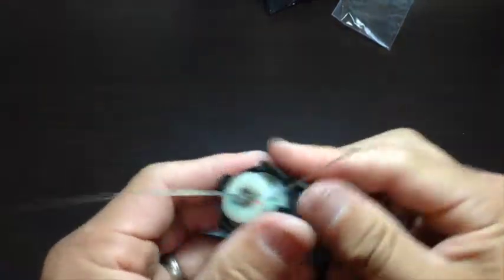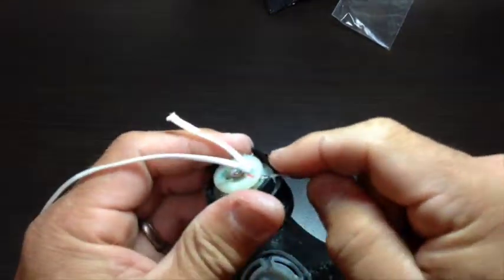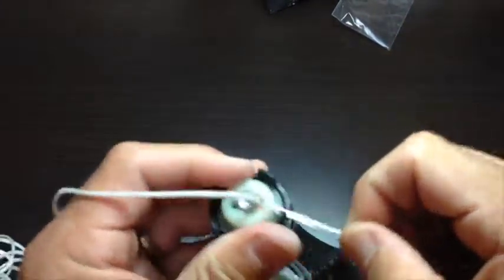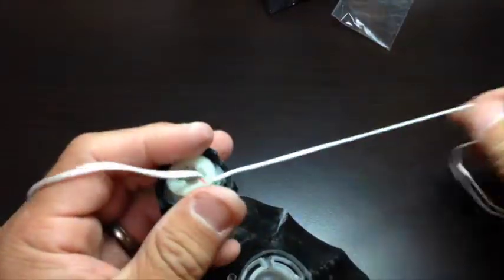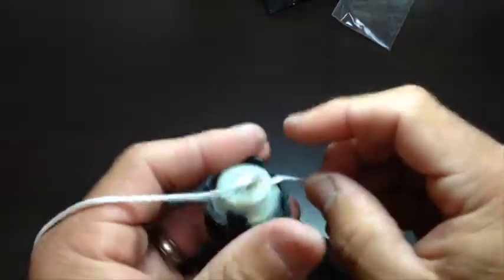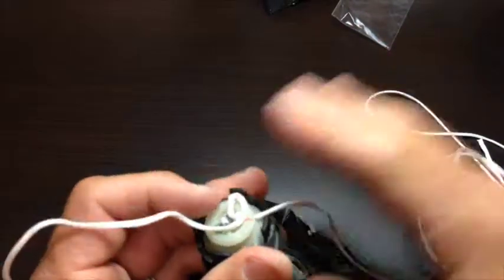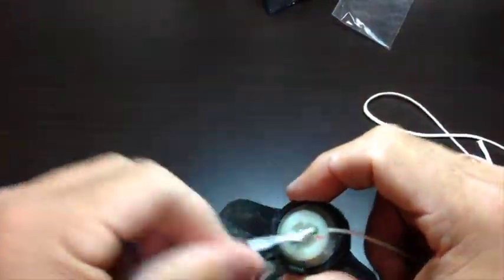Now we're going to pull the length of filament through the dial — pull it all the way until we get to the end — and once we get out to the end, we'll go ahead and do our knot to anchor this down.